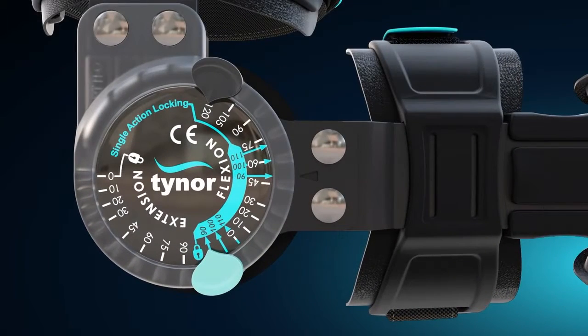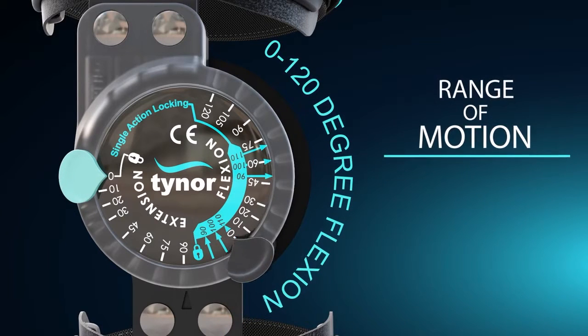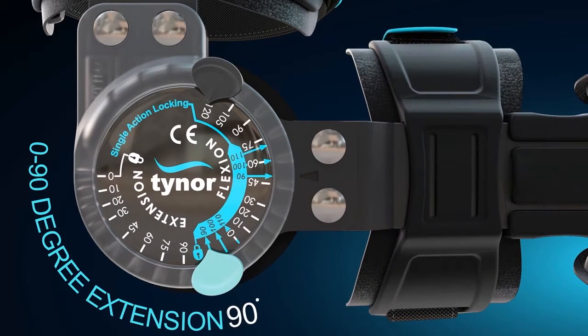A very simple to operate range of motion dial has a flexion from 0 to 120 degrees and an extension from 0 to 90 degrees.